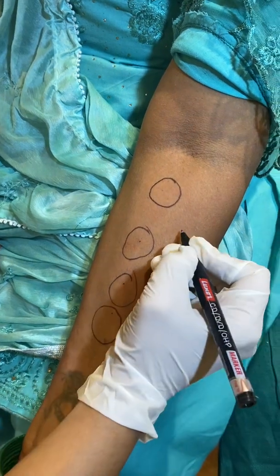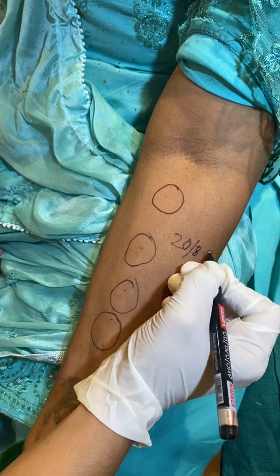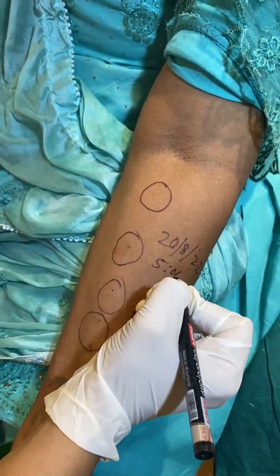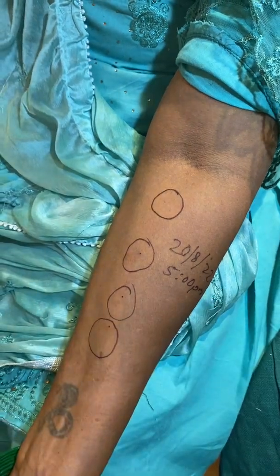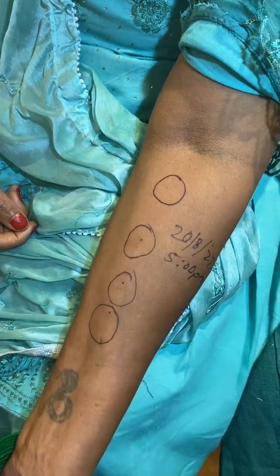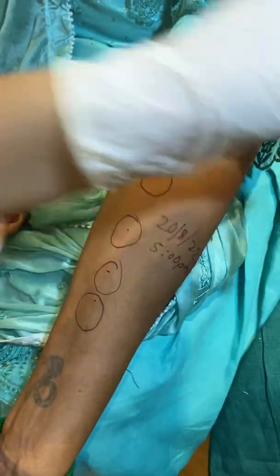Don't forget to note the date and the time. Today is 20th of August and the time is around 5 p.m. This is how we do a pathergy test in the skin. Now I will demonstrate how to do the pathergy test in the lip area.